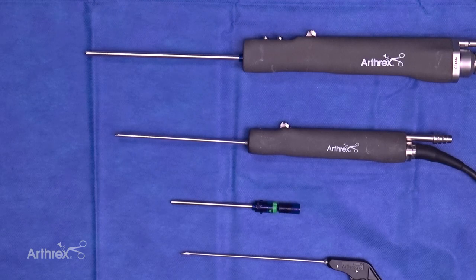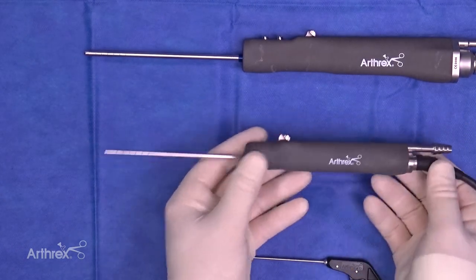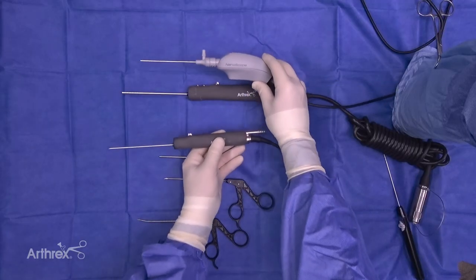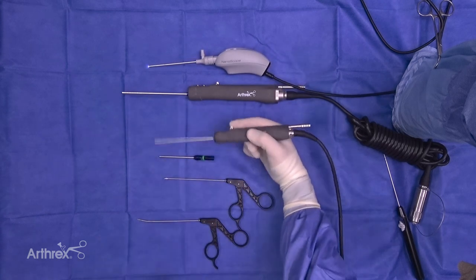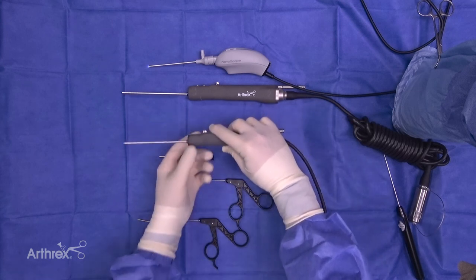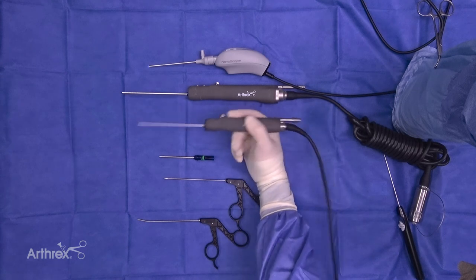The diameter on the Nano Sabre is actually a little bit smaller than this dex shaver. The small hub handpiece is lighter in weight than the standard handpiece, and thus, when you're doing Nano Arthroscopy, there's a very natural weight distribution, and it also allows for more dexterity and control. You can hold it like a standard handpiece if you'd like, but it's light enough that you can actually hold it kind of like a pencil if you're really doing some fine resection work.